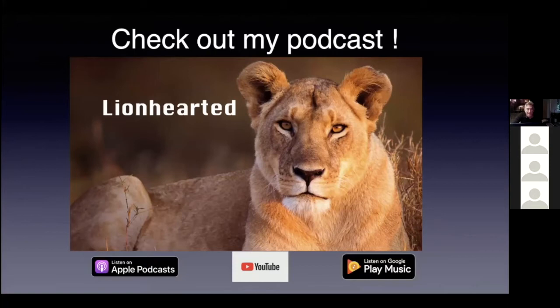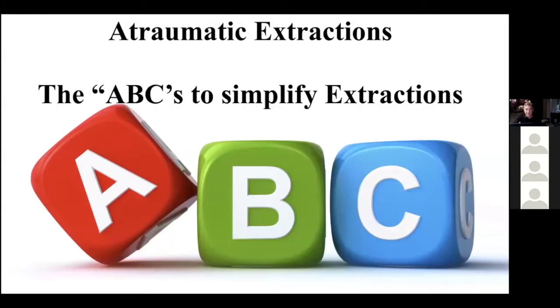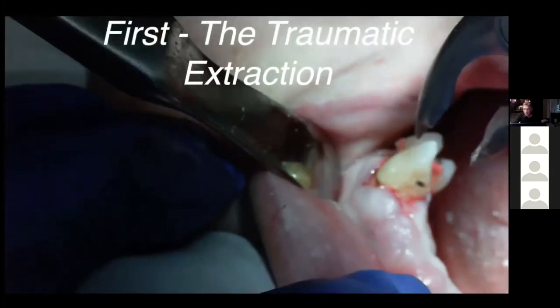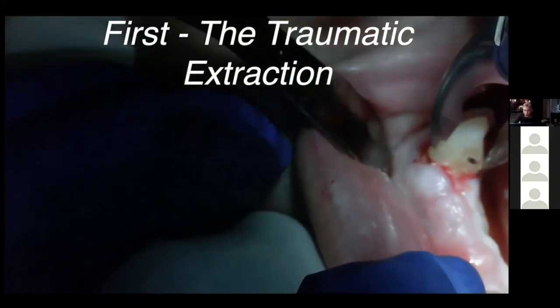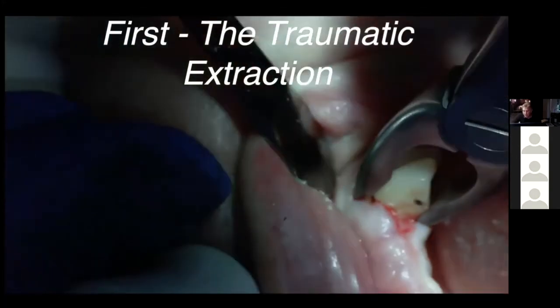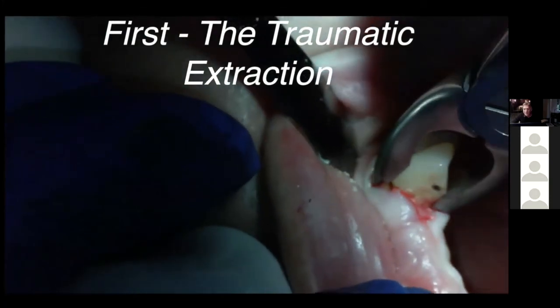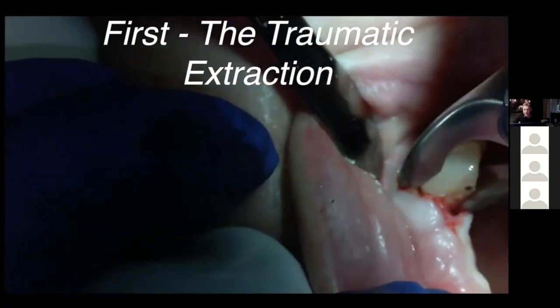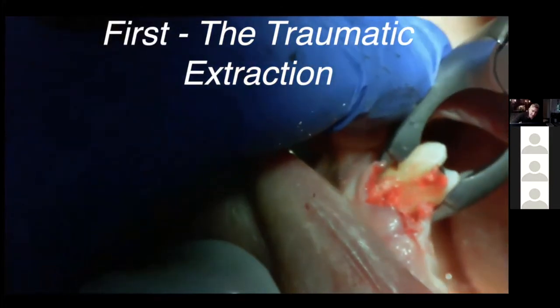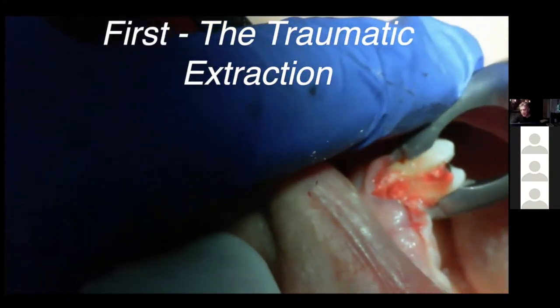So let's get to the ABCs. What do we need to do? Well, first, this is what not to do. Watch the video. It's quick, I think. So you're going to see me go in with a forceps, and you're going to see me rock buccally, lingually. And okay, I get the first tooth out without too much complications.